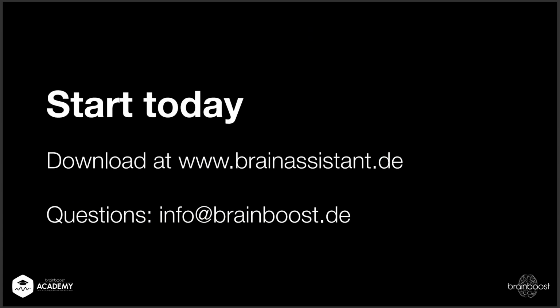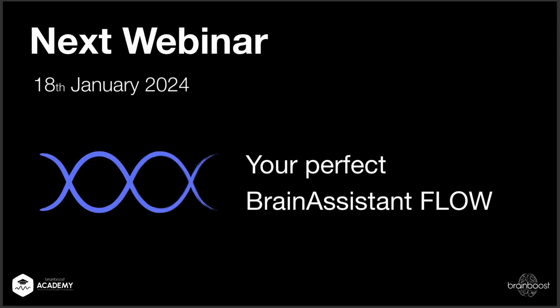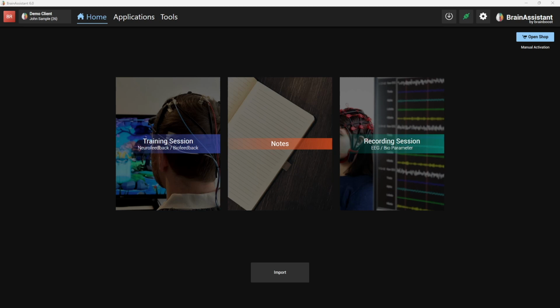Let's do it. So right now there's time for questions. Maybe I already said this, but are flows available for all EMs? Yeah. If I'm using the Nexus, I can use flow, but I would be during a neurofeedback session and not EEG, because I can't do it with Nexus. Hope that makes sense. Julie, yes, it makes sense. You can, so it works with all amplifiers we have, all.